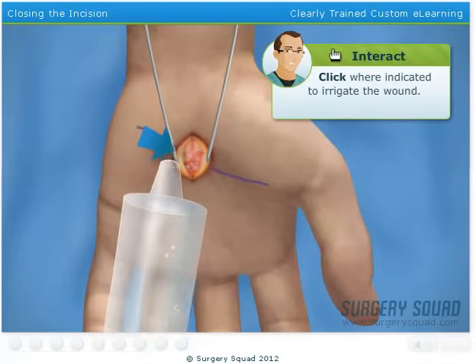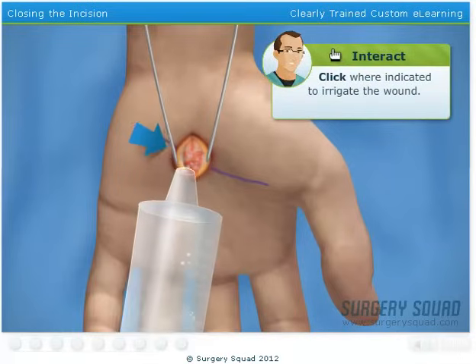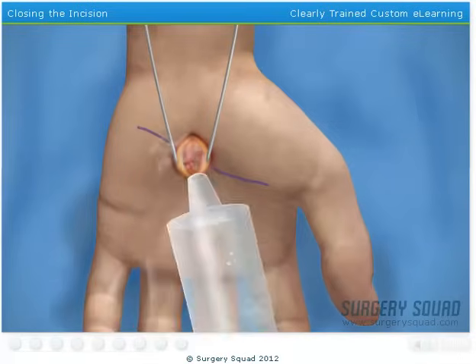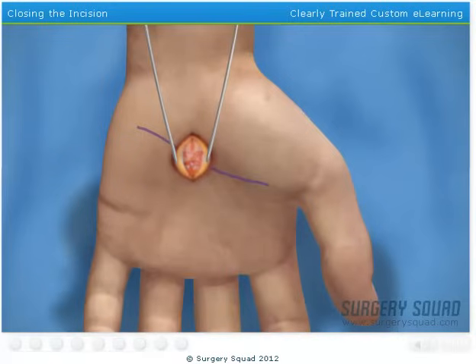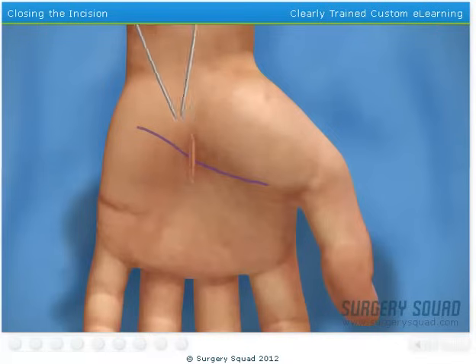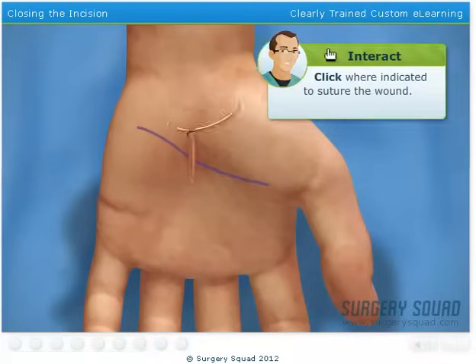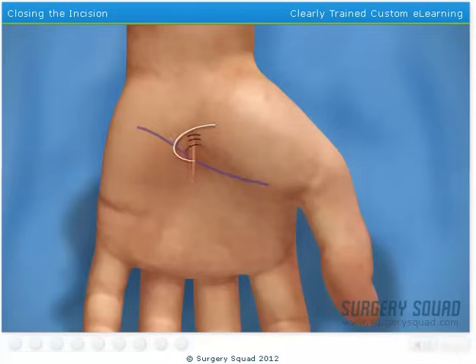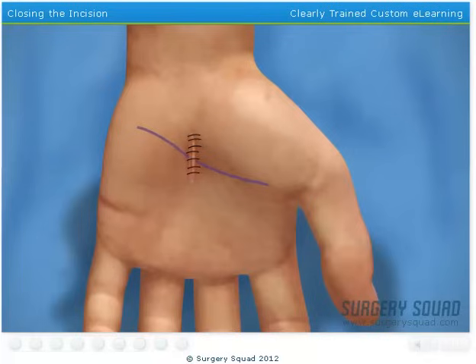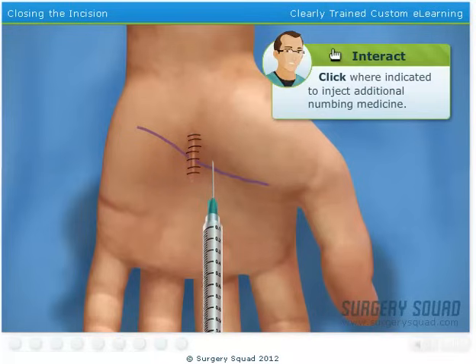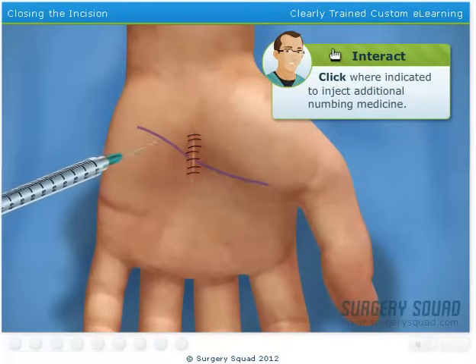Go ahead and irrigate the wound. When you're finished, I'll release the tourniquet, allowing blood to flow back into the hand. Now you'll close the wound using non-absorbable sutures. With the wound closed, we'll inject additional numbing medicine around the operating site to help relieve some of the immediate pain the patient may feel after surgery.